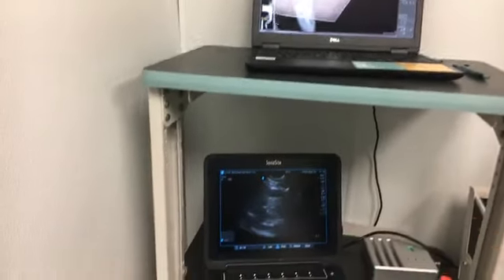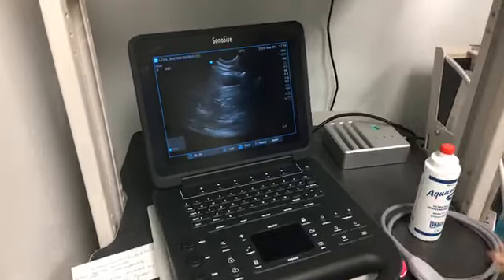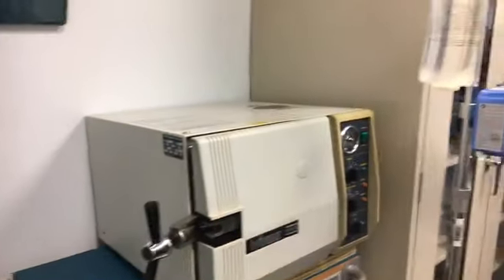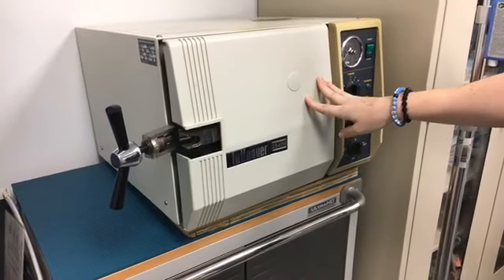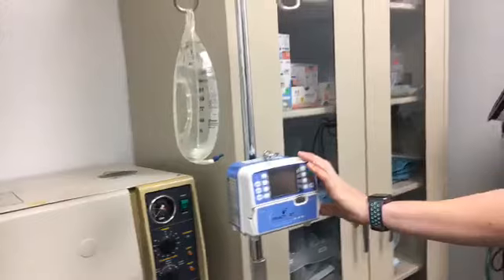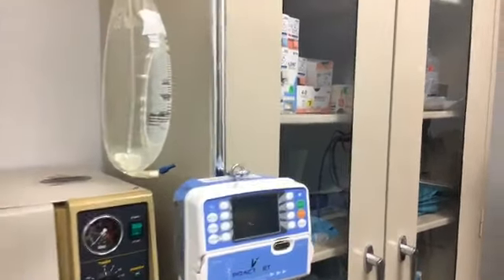Down here we have an ultrasound unit. This was actually funded by a grant from the McLean Contributorship, so we're very grateful for that. This is a really cool ultrasound unit — we use it a lot for various things. If you swing back this direction, we've got our autoclave. We use this to sterilize instruments. Basically it heats them up really, really hot — we use hot steam sterilization so that we have sterile surgical instruments for any surgeries we need to do.